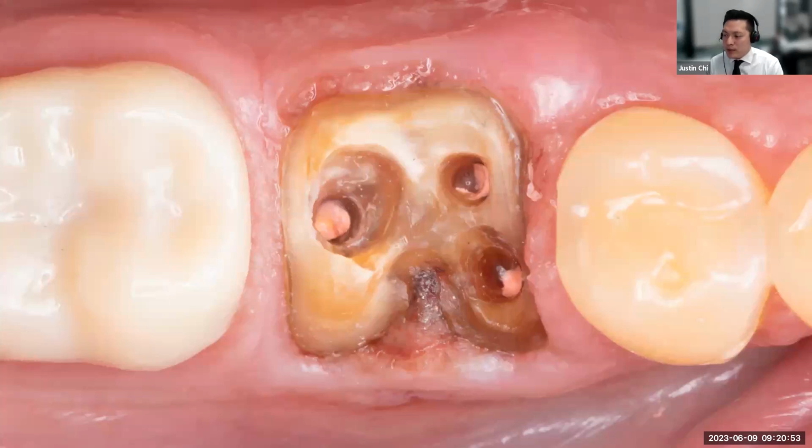So this is what was presented. I didn't come across any fractures in the preparation. And yes, there is quite a bit of loss of tooth structure. And I know many of you might see the situation and determine this hopeless. But as you can see, I opened up into the access channels. And since I am going to chairside mill this restoration, I'm not worried about provisionalizing this. So my restoration is actually going to extend into these access channels. So it's going to possess, in a sense, the post along with the buildup and of course the final restoration.